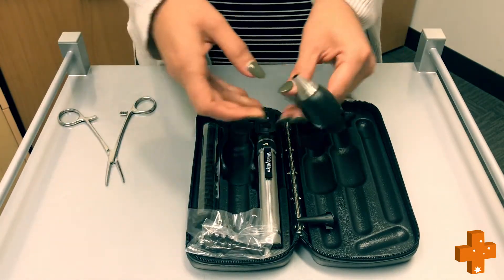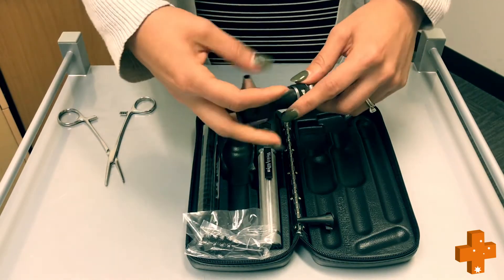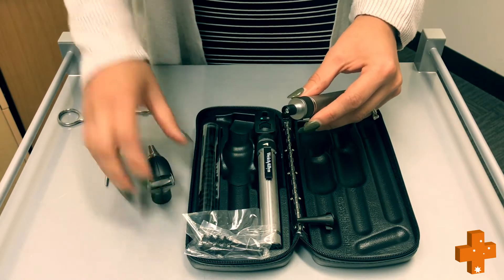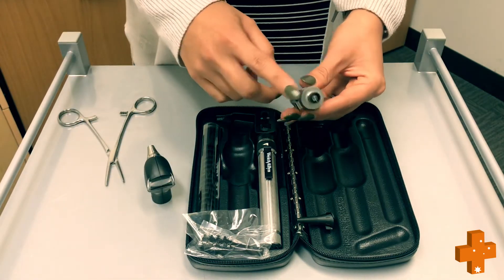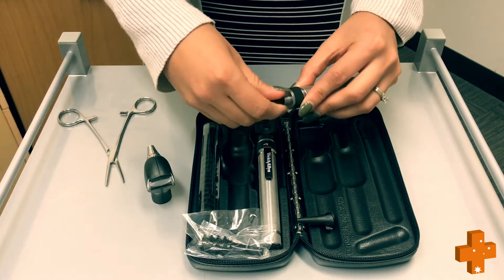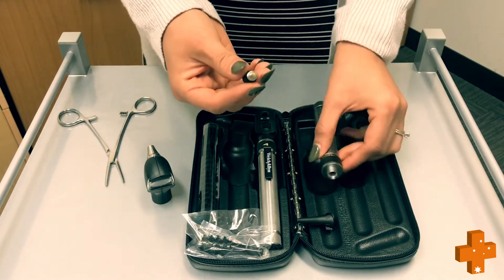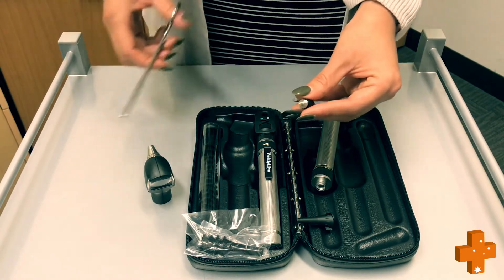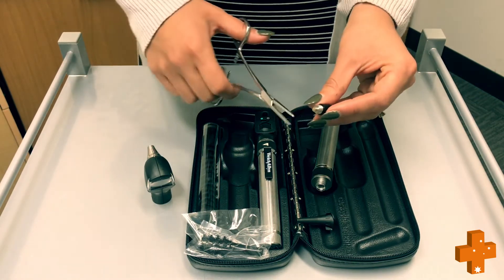To locate the globe, remove the head of the otoscope. Locate the globe — it is different in every unit. You can remove the globe with your forceps or hands.